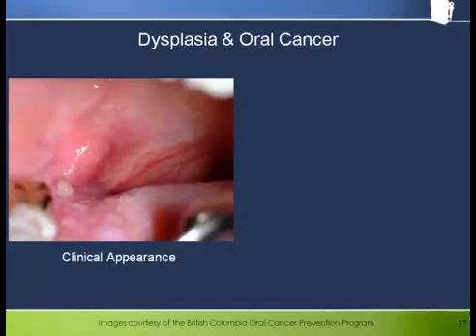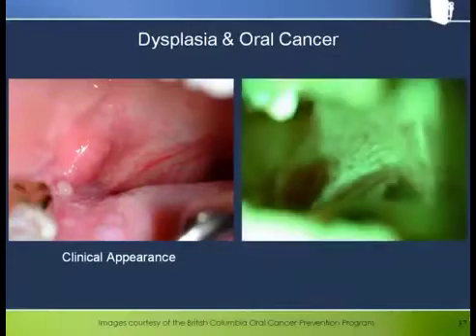An interesting case from the days when the VELscope was a prototype under evaluation at the BC Cancer Agency. This patient had a prior history of oral cancer and presented to the dysplasia clinic with some discomfort. The specialist who saw the patient assumed it was the area near the small white polyp and was planning to biopsy the area adjacent to it. Before doing this, though, the patient was observed through the VELscope, and the intensely dark area with quite well delineated borders was discovered slightly posterior to the obvious polyp.